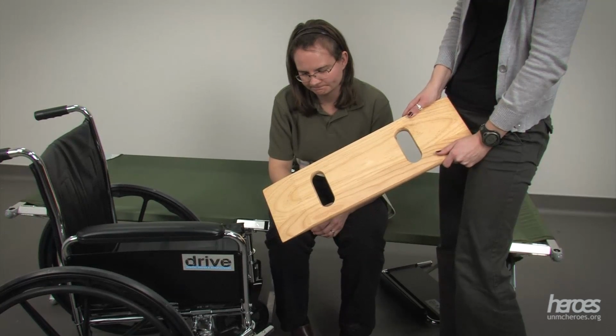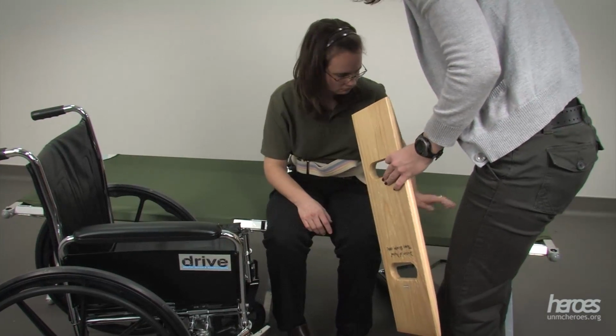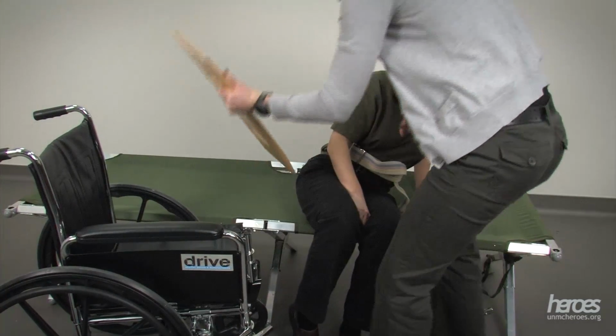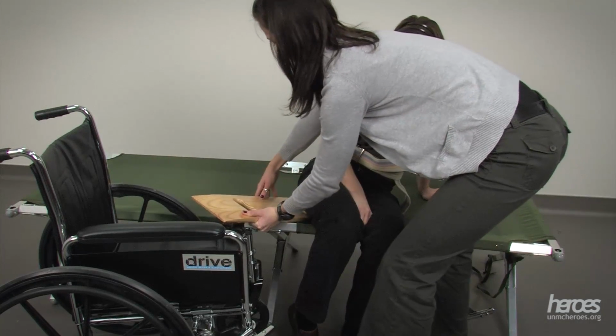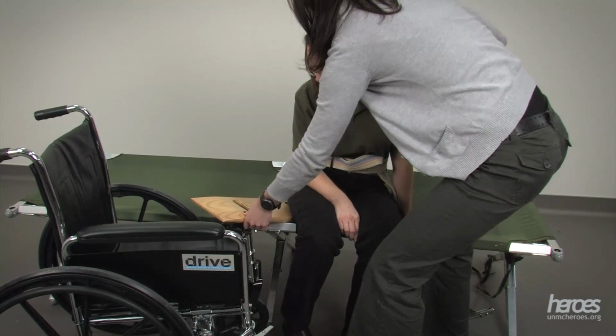Ask the individual to shift their weight onto their hip furthest from the wheelchair. Position one end of the slide board under the individual's upper thighs and buttocks nearest to the wheelchair. The other end of the slide board will rest on or over the wheelchair.